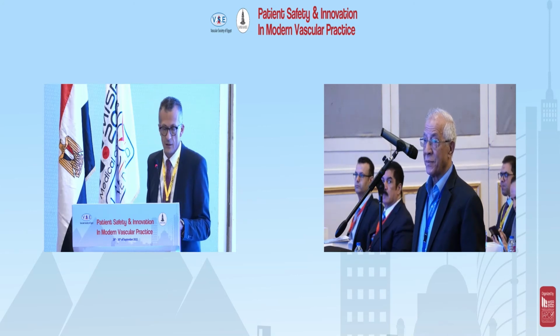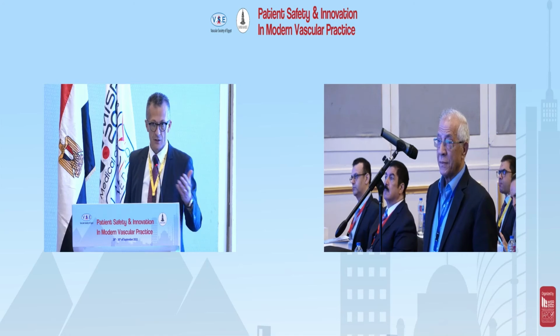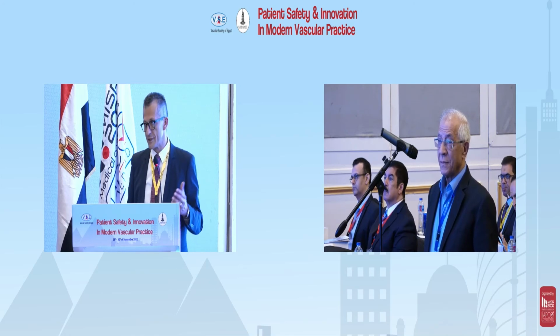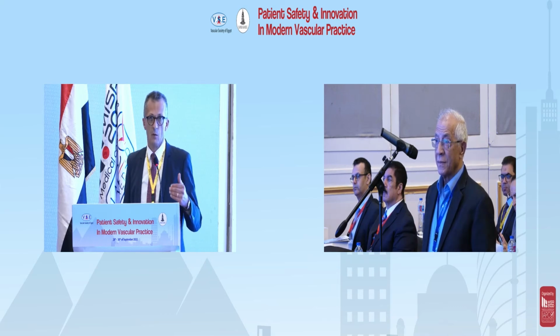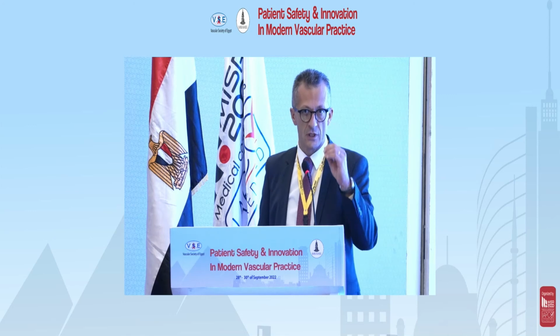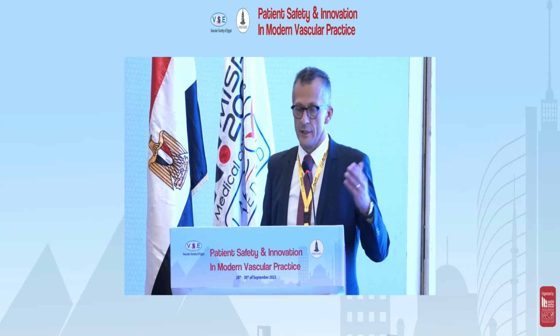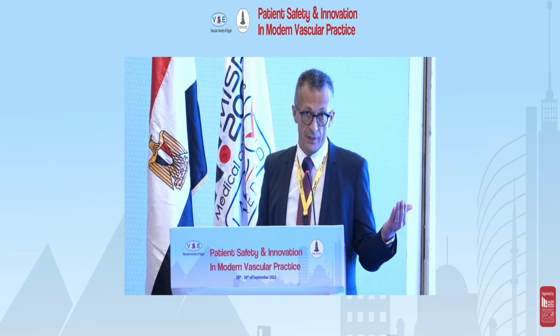No, yes, of course, it's completely different, because in case of SFA stent, if it's a bare metal stent, not covered stent, it's a hyperplastic material, neo-intimal hyperplasia with a small thrombotic central portion. In this case, it's different because it's a covered stent, then no hyperplasia, but all thrombotic material.